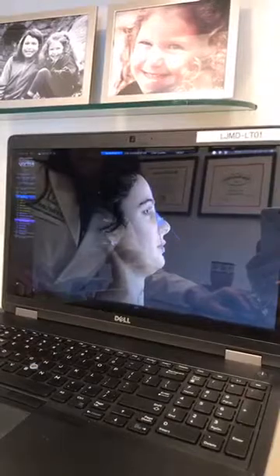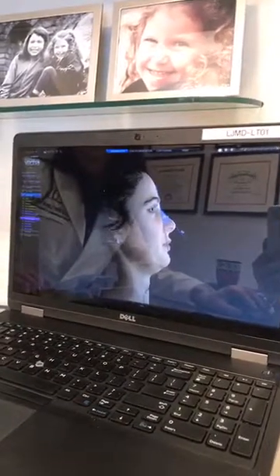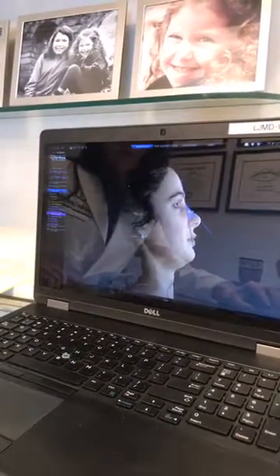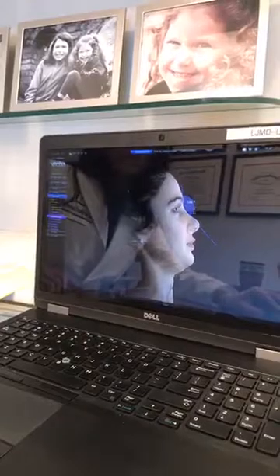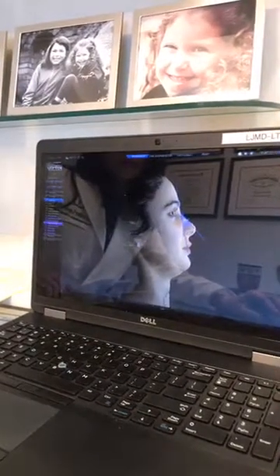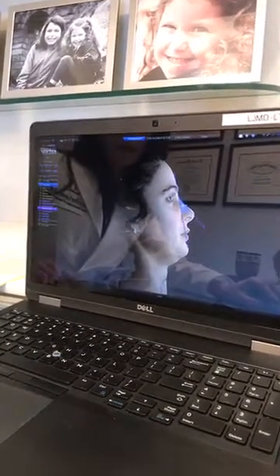We have the nasofacial angle here, which ideally is around 36 degrees. Sorry if you missed my nasofrontal angle; this should be about 115 to 130. Going back to the nasofacial angle, this should be around 36 degrees, and we see it's about 29.